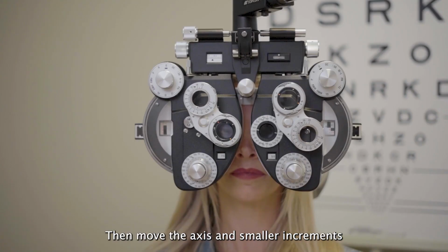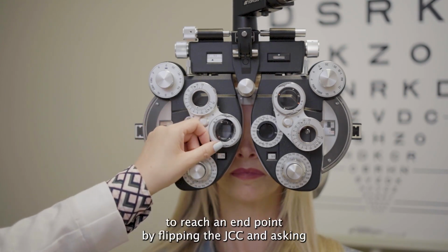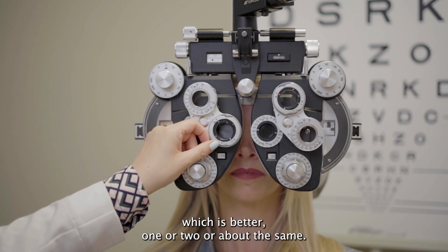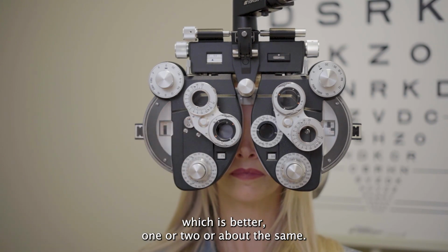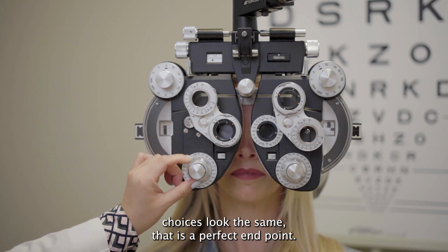Then move the axis in smaller increments to reach an endpoint by flipping the JCC and asking which is better, 1 or 2 or about the same. If the patient says the choices look the same, that is a perfect endpoint.